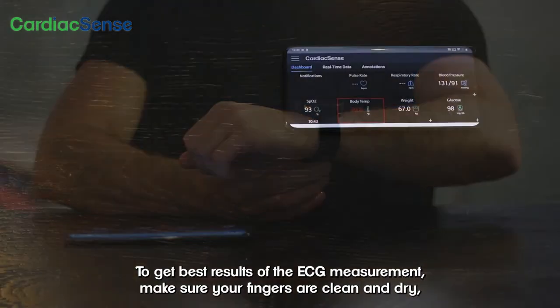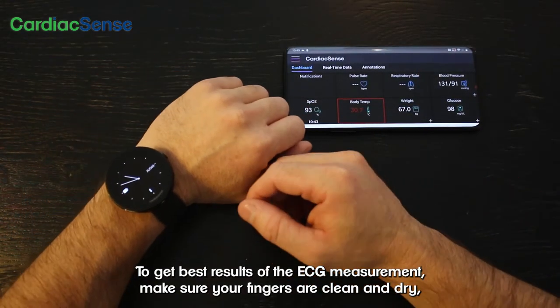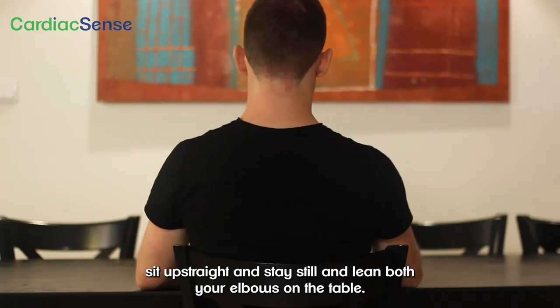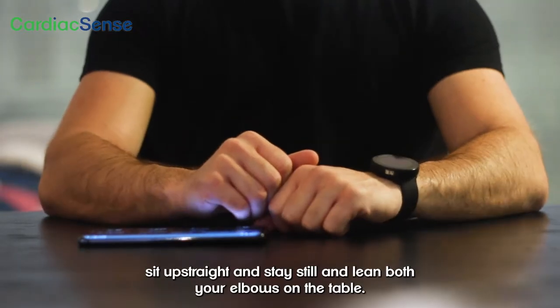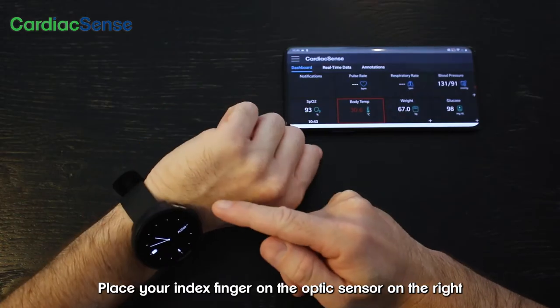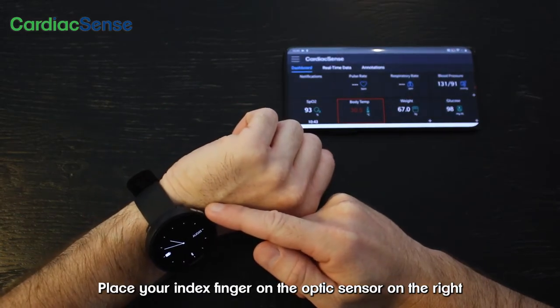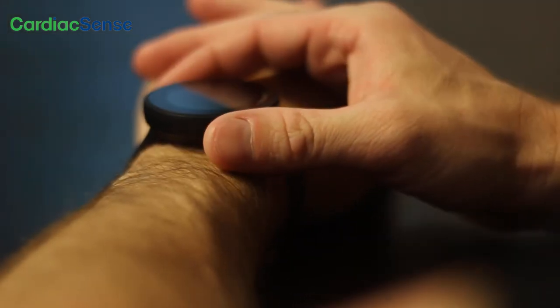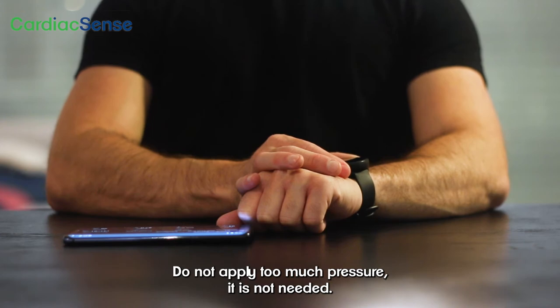To get the best results of the ECG measurement, make sure your fingers are clean and dry. Sit up straight and stay still, and lean both your elbows on the table. Place your index finger on the optic sensor on the right and your thumb on the oval metal sensor on the left. Do not apply too much pressure — it is not needed.